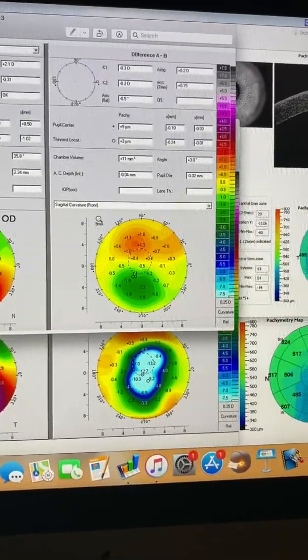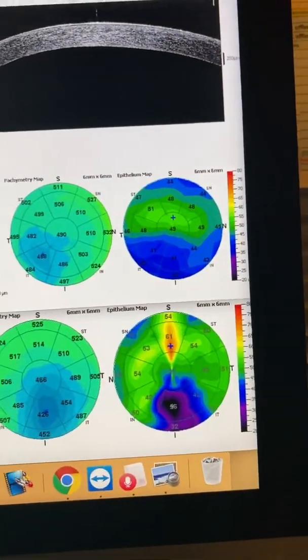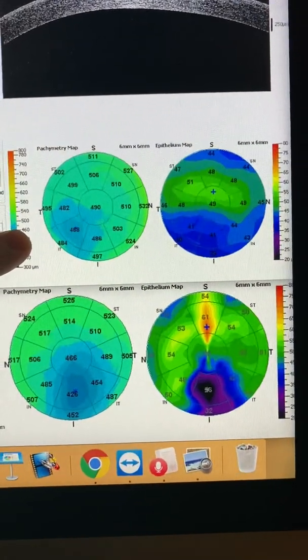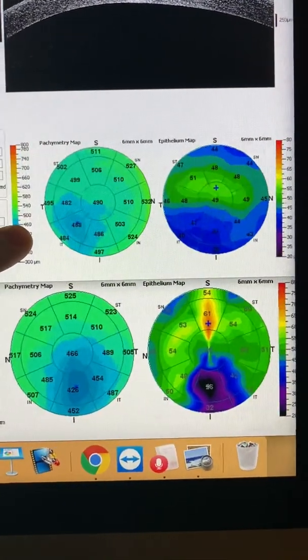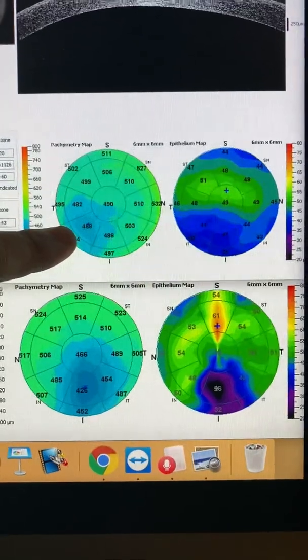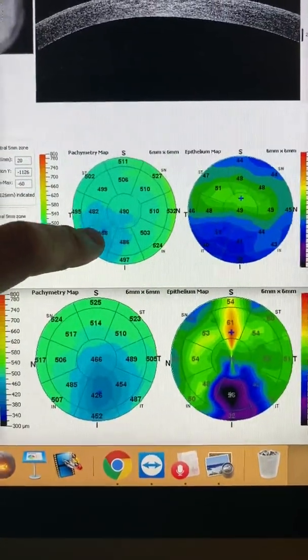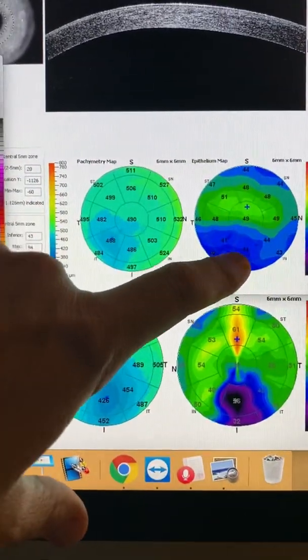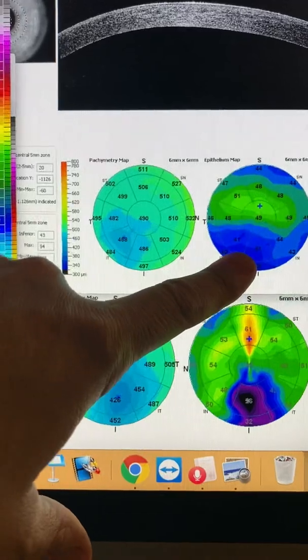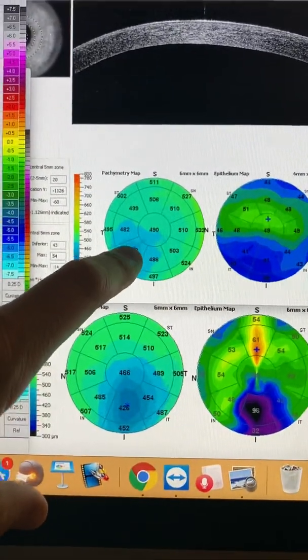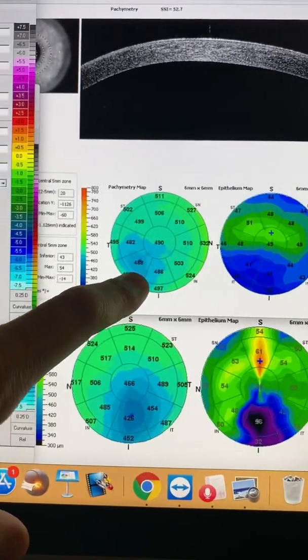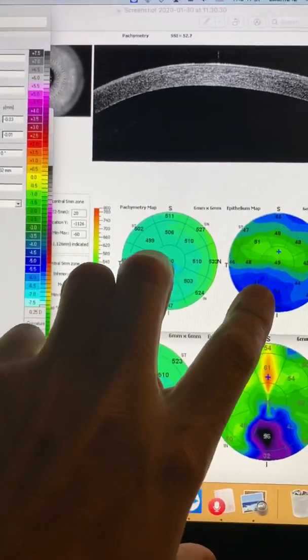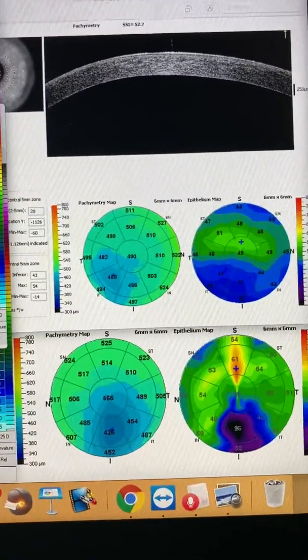Now, if we look at the OCT imaging, very important in our assessment, and we've tried to propagate this knowledge in this type of assessment. These are the Optiview 6-millimeter cornea and epithelium maps. We can see that the cornea epithelium is very thin over the steepest and thinnest part of the cornea, depicting active disease in this patient.